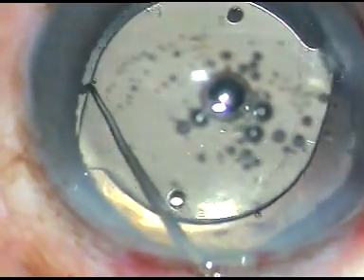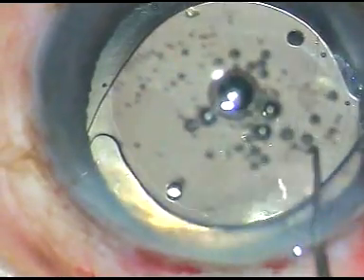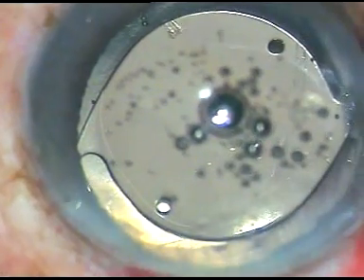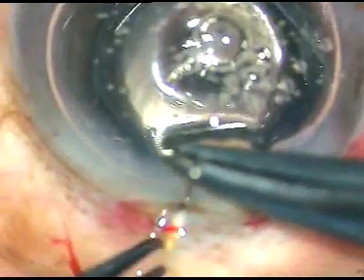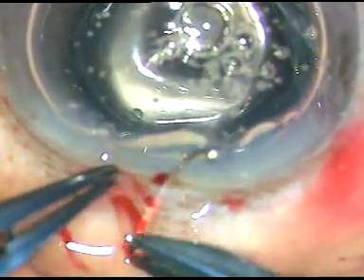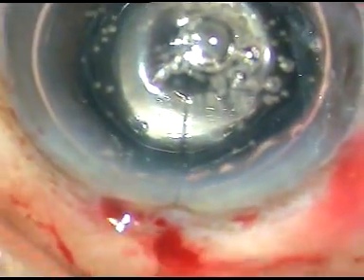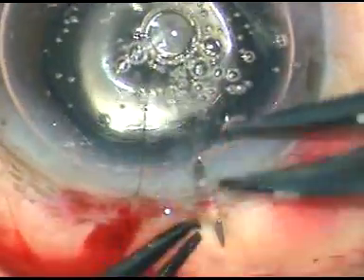And now I have to suture this wound. So what I do is I inject a big air bubble in the anterior chamber, and in this case I am doing a continuous shoelace suture.